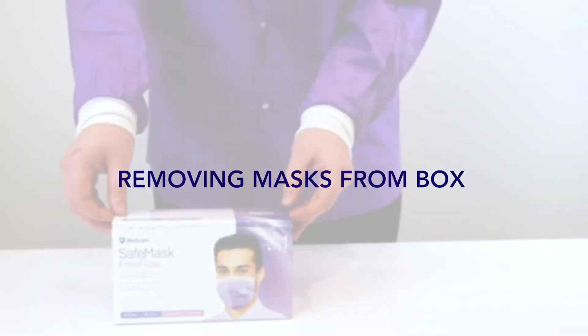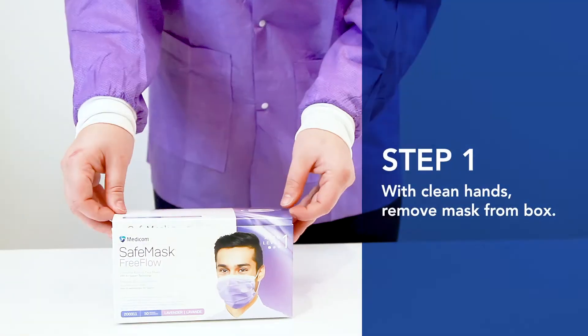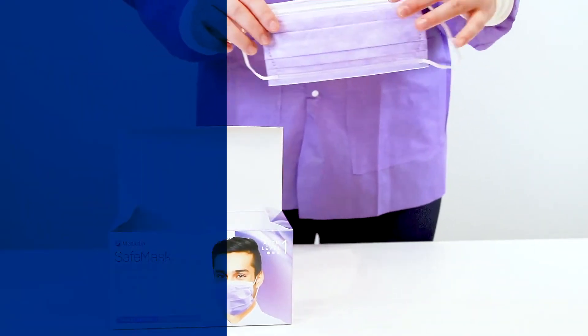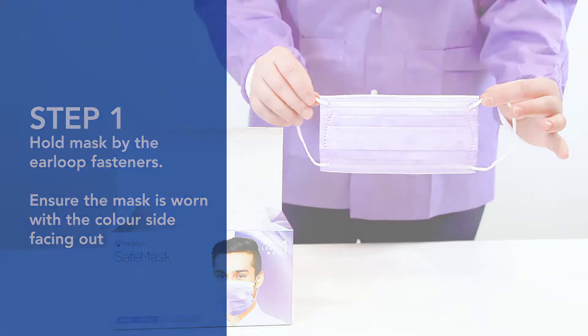Step 1: Removing a mask from the box. With clean hands, remove a mask from the box. Hold the mask by the ear loop fasteners. Ensure that the mask is worn with the color side facing out.